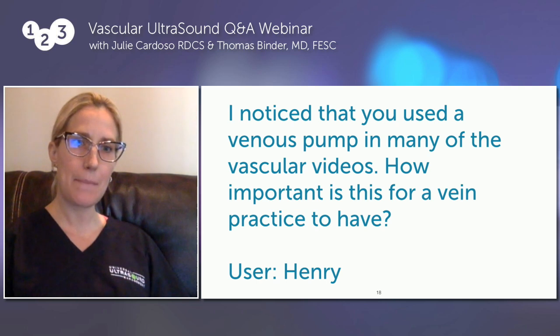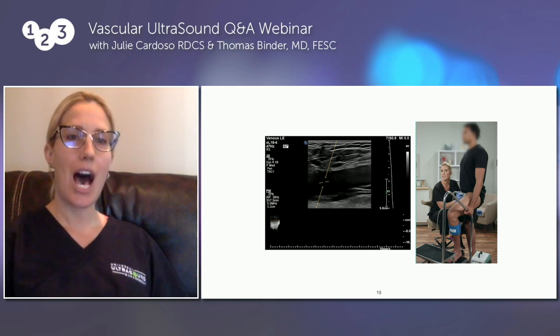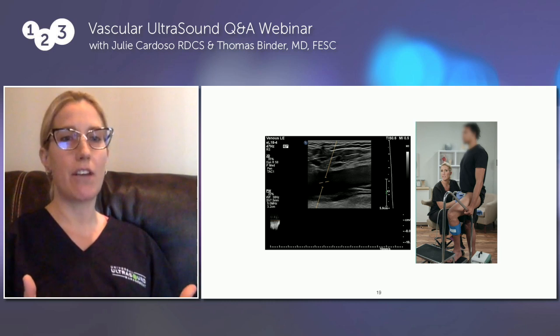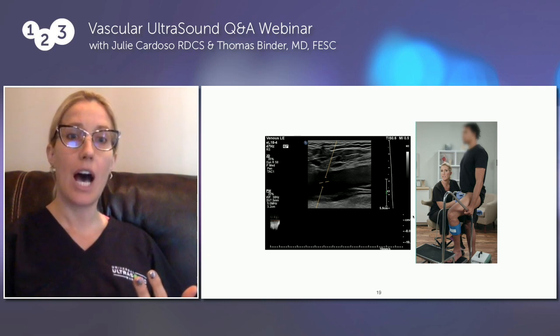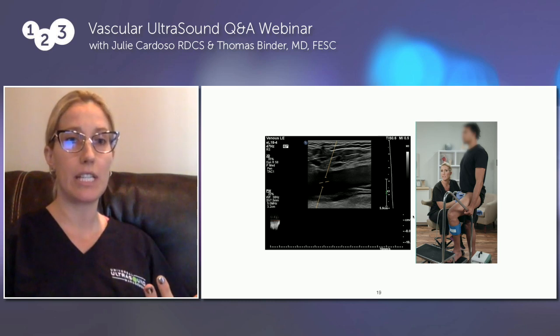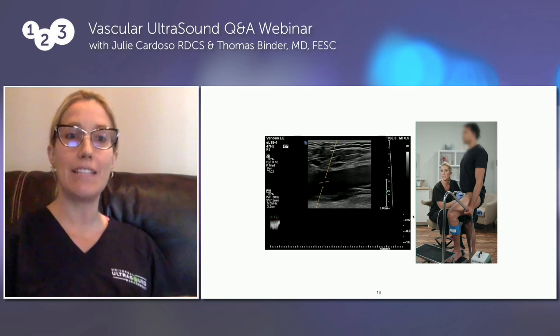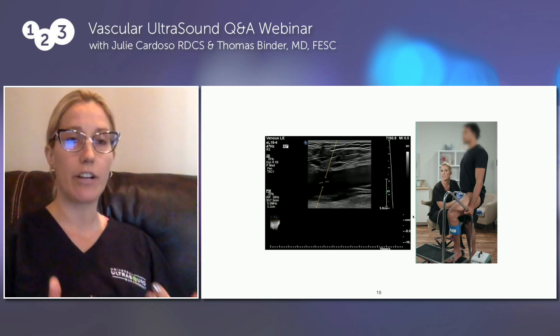You have the image of the pump? Yeah, here's the image of the pump. There we go. The pump is effective in several ways. One, ergonomically for the patient and for the sonographer. Also, there is no variability as far as augmentation maneuvers, because it will be the same amount of pressure applied at different portions of the leg for augmentation. So two reasons: ergonomics, and variability between sonographers as far as the augmentation.